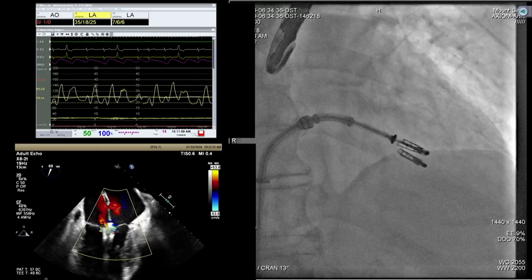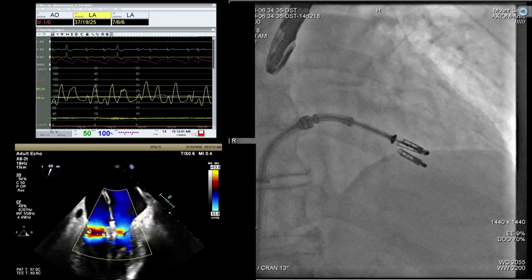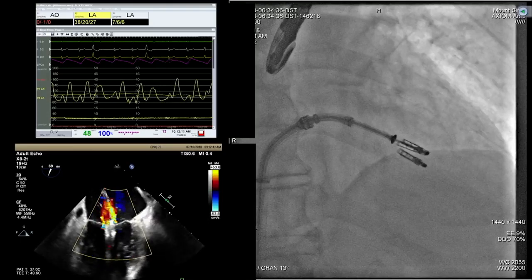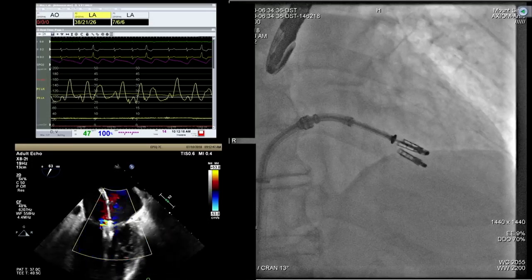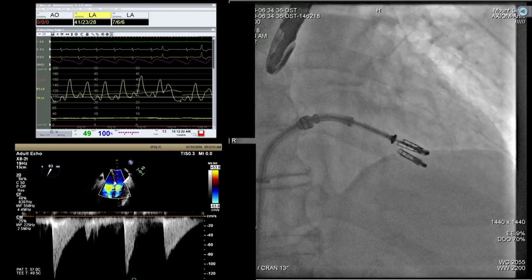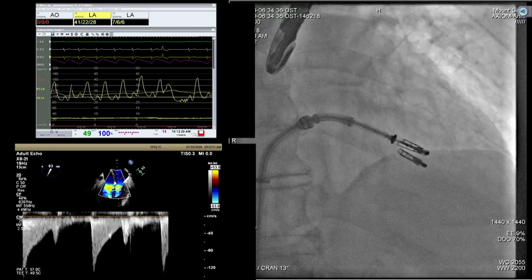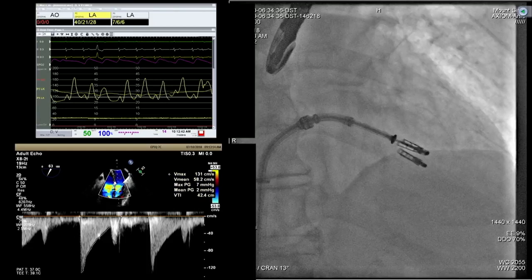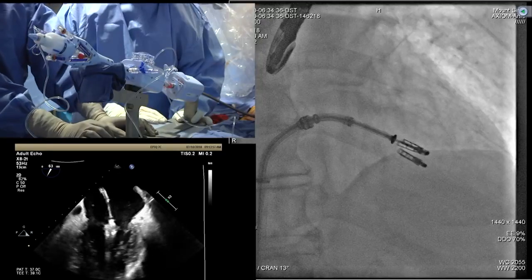Next step. Back to the slides. Regress a little more to the side, or you don't think so? Just so we are ready to release. Check the gradient, please. Gradient is fine, no change. Okay. So I think, if you're happy, we'll release this.